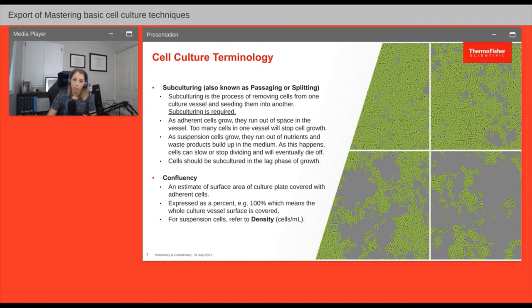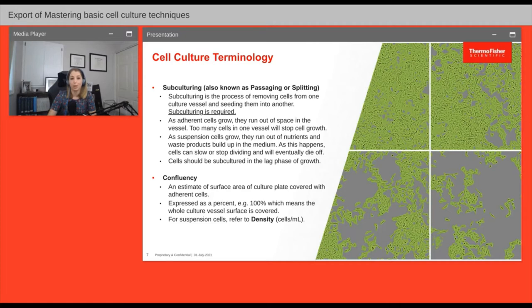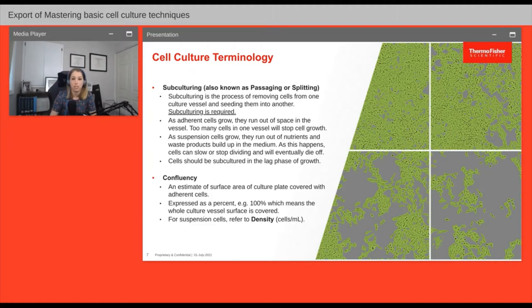Every few days you will need to move a fraction of your cells from one vessel to another so adherent cells have more space and suspension cells have more nutrients. The technical name for this process is subculturing, also commonly called passaging or splitting. It's important to keep an eye on your cultures to ensure they're not running out of space or nutrients. For adherent cells, examine them with a microscope to see the proportion of growth surface area covered by the cells — this is called confluency.